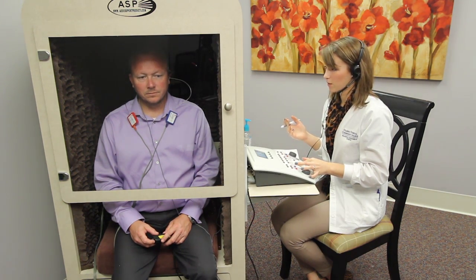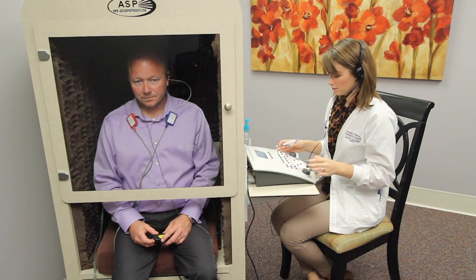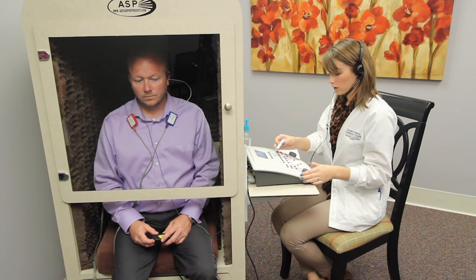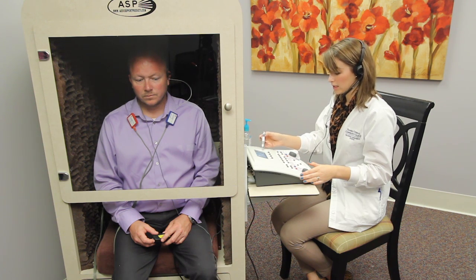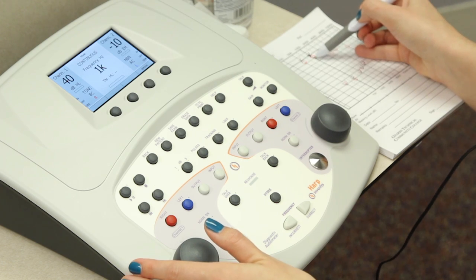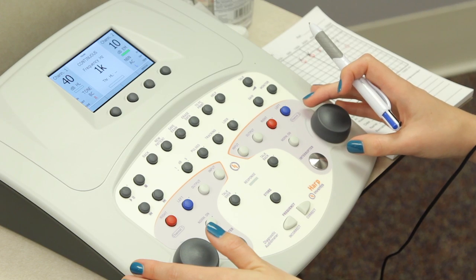If at any point you hear the tone in your left ear, let me know. Do you have any questions? Okay, we'll get started then. So we're going to start at 40 decibels in the right ear, and in the non-test ear we're going to put in 10 decibels of masking noise.